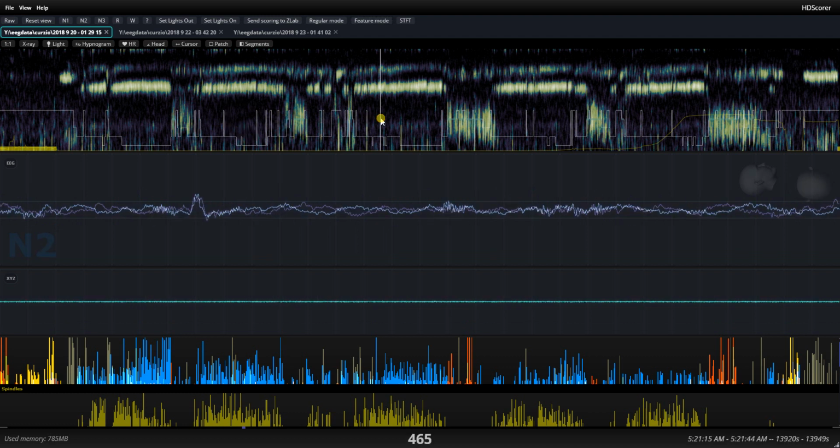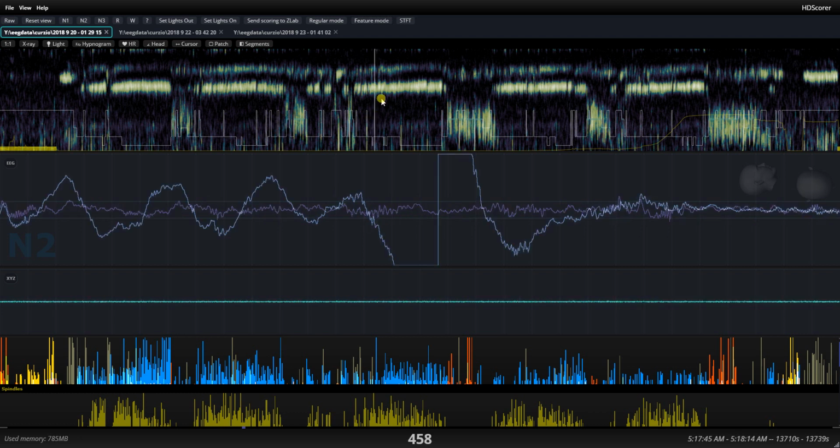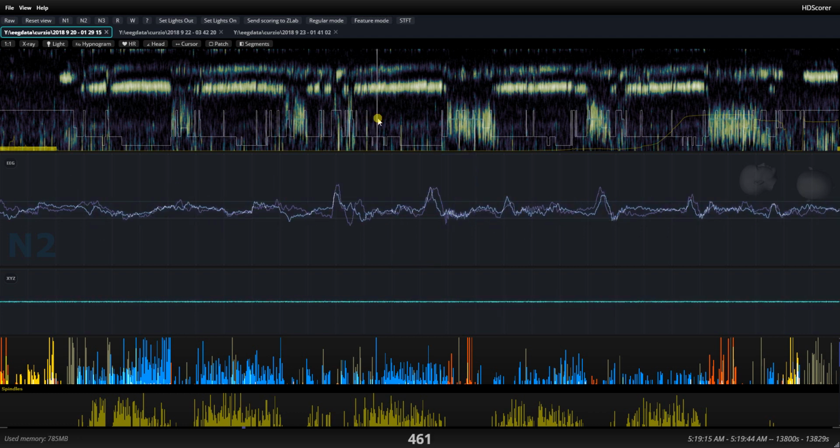Then you can do the same exact thing right here, because, for example, to me it looks suspicious that I was still in N2 sleep on the third sleep cycle.